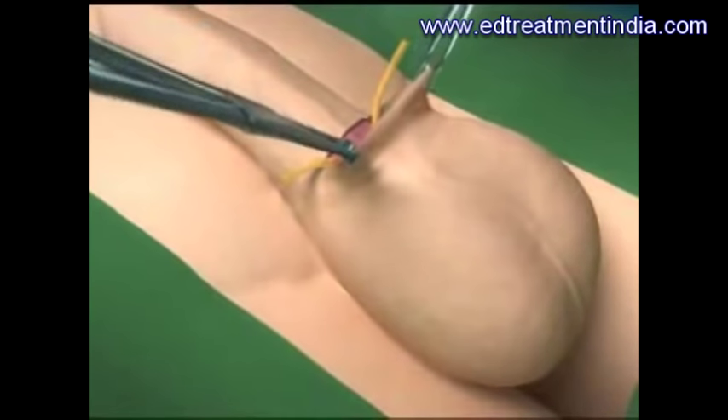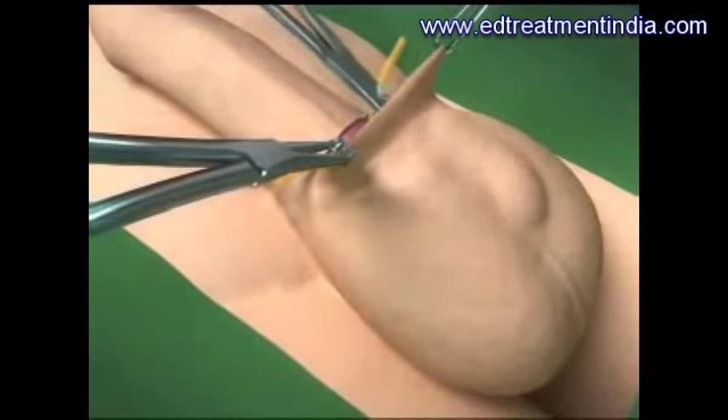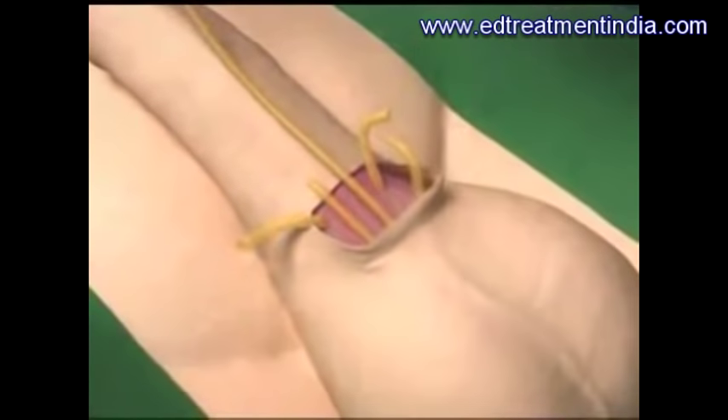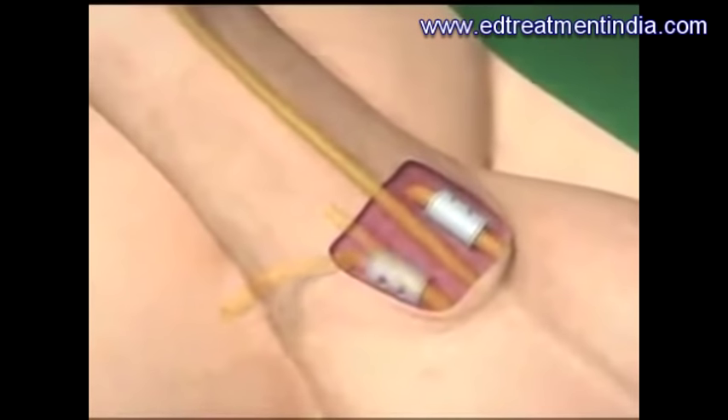A pocket is made for the pump. The pump is placed deep in the scrotum. Then connections between the pump and the cylinders are made with special connectors.